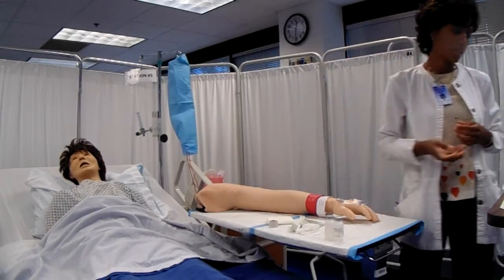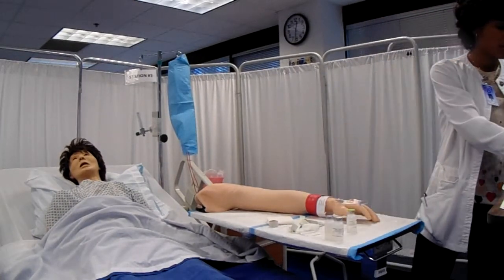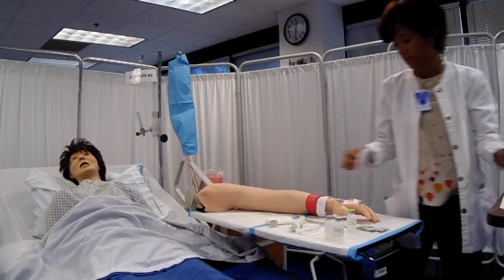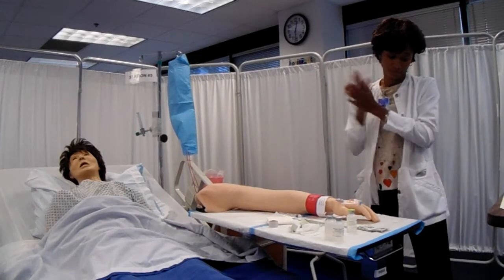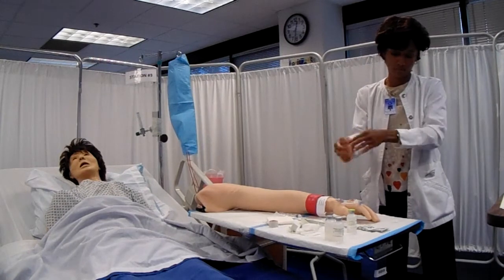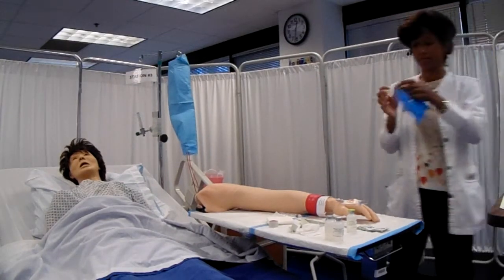I have the correct medication here, so now I'm going to go ahead and get ready to pull up my meds and give it intravenously. Any questions? No? Okay. Let's perform hand hygiene just one more time. And I'm going to don a new set of gloves.